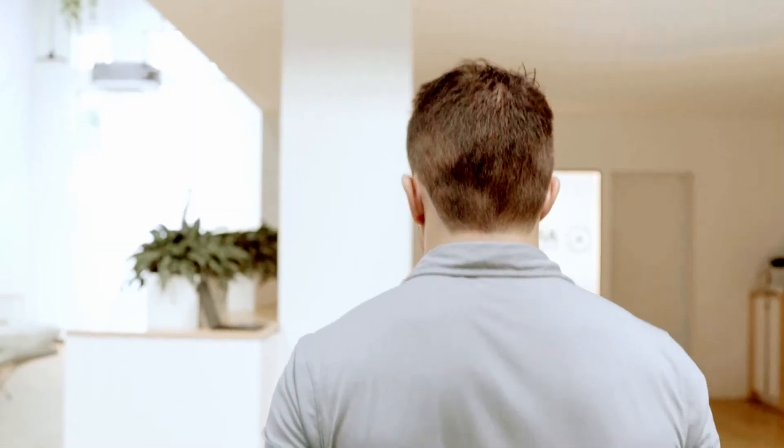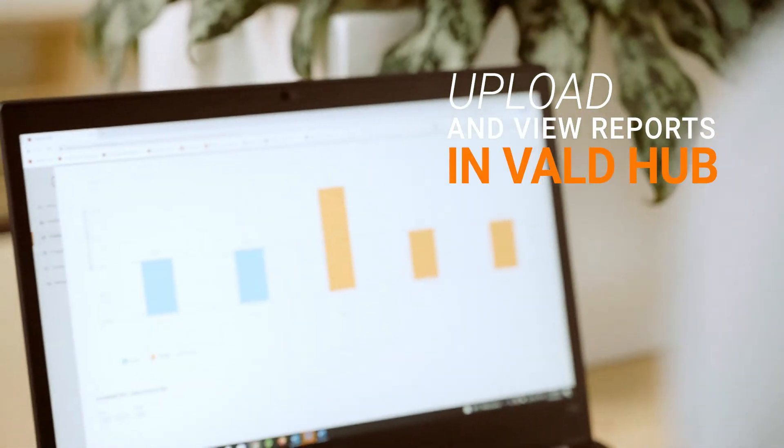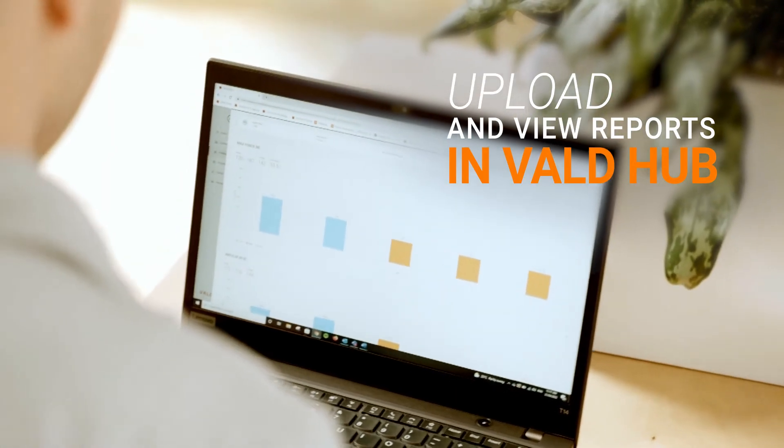Once you're done with a test, there's no need to take notes or type measurements into a spreadsheet. Your client's results are automatically uploaded to VALD Hub, stored against their profile and visualized in configurable reports.